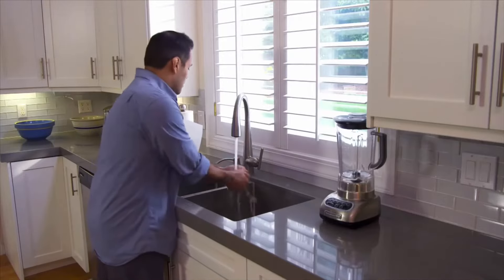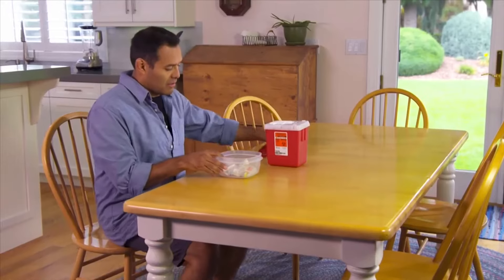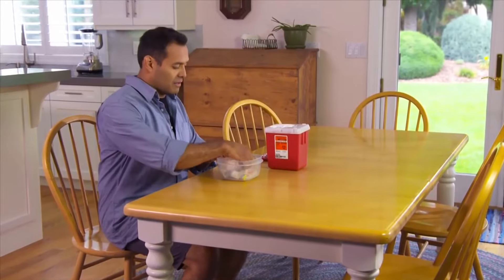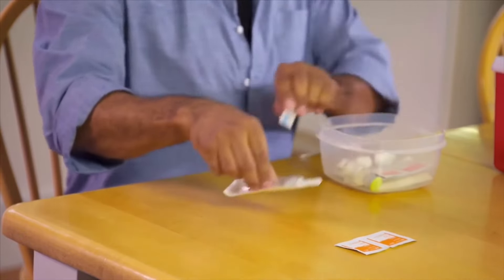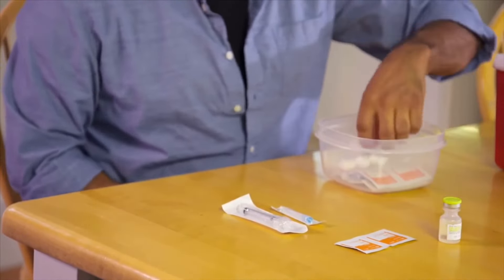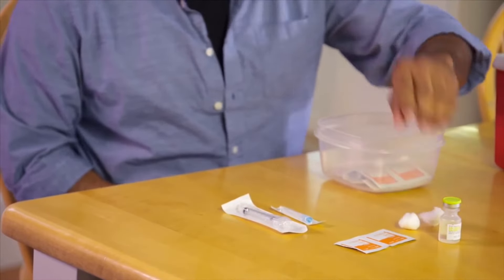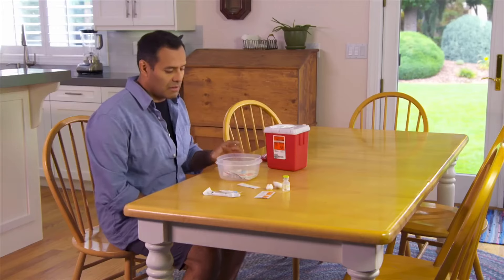Start by washing your hands with soap and warm water. Make sure you have everything you'll need: alcohol pads or cotton swabs dipped in rubbing alcohol, a disposable syringe, the medicine you'll be using, cotton balls and adhesive bandages, and a place to safely throw away the used syringe.